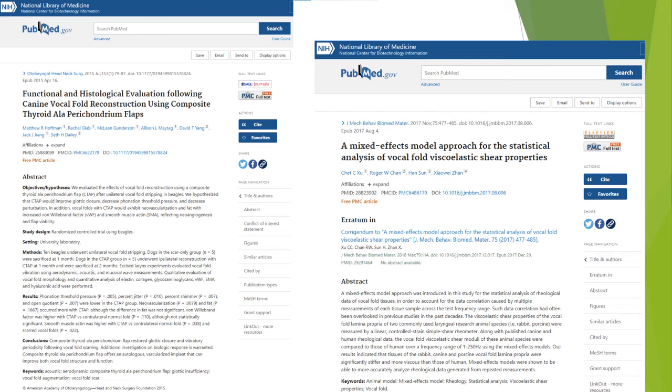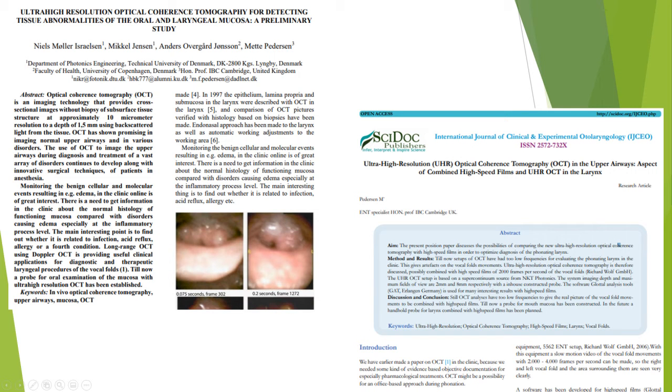These two studies involve the aspects that have been overlooked for many years in models and quantification of the vocal fold function. It is illustrative to the scale of the problem that even in 2017 they have to use animal studies. We have until now made plans of ultra high resolution optical coherence tomography, especially for reflux patients, but also for online measurement of optical coherence tomography values of the vocal folds during movement. The equipment is under development.